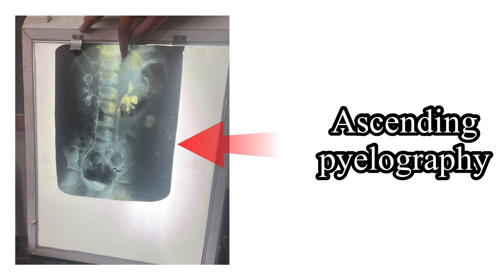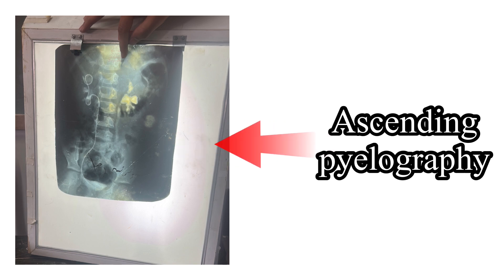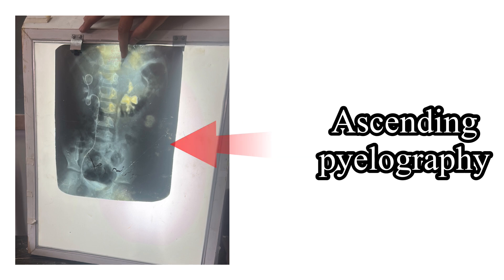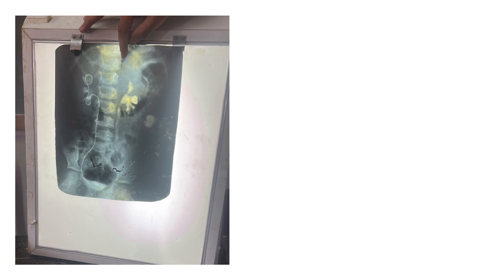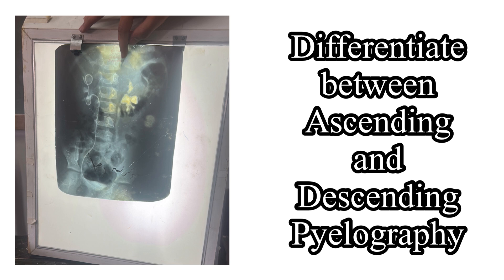The X-ray seen here is that of ascending pyelography, also known as retrograde pyelography. The dye is injected directly into the ureter through a ureteric catheter, which is guided through a cystoscope. To differentiate between ascending and descending pyelogram: in ascending pyelogram, only one pelvis is outlined, and the catheter used is clearly visible in the X-ray, as seen on the screen.